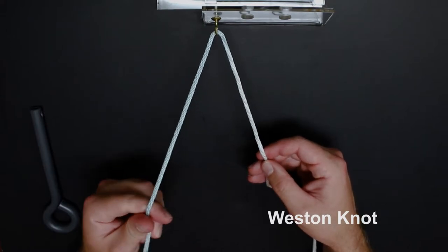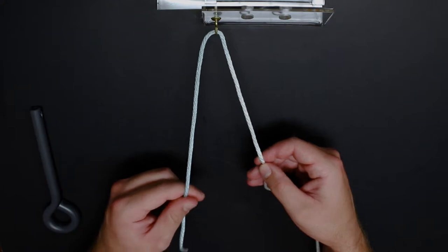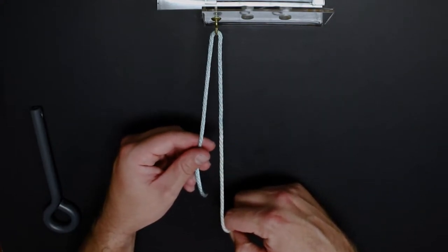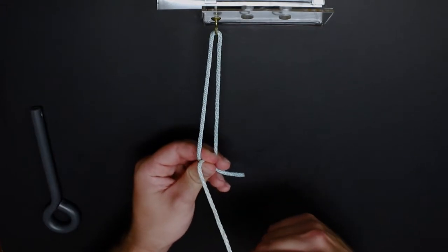The Weston knot is a sliding locking knot. Start with the post limb in my left hand and the loop limb, in this instance, in my right hand. To start, the post limb is shortened and then the two sutures are pinched between the fingertips.